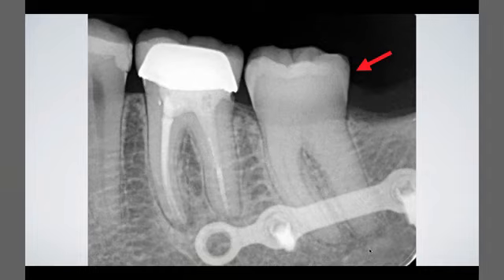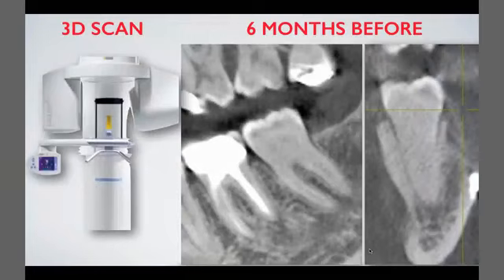So I told the patient I couldn't see any problem, but when I checked her file in our center's system, I saw that she had a CBCT done 6 months before to do an implant on the upper right area. I checked the cone beam for this patient, and I found everything is perfect, no periapical lesion, and everything is going well. So I told her to just relax and use your night guard because she is a bruxism patient. Just use your night guard, and that's it. Maybe she was very afraid.